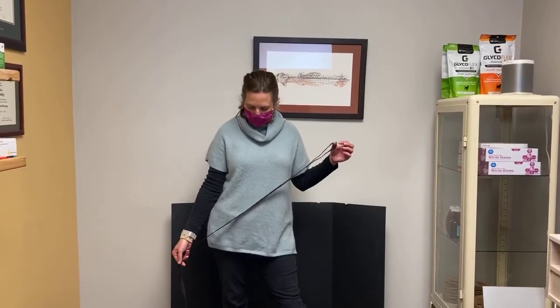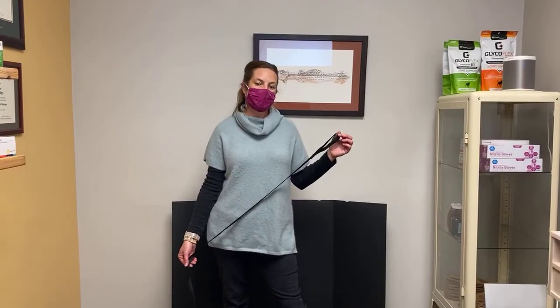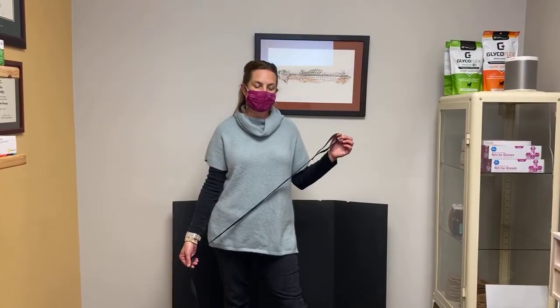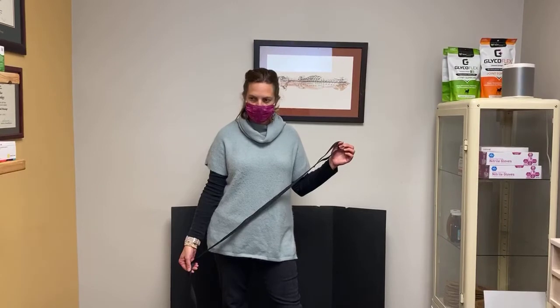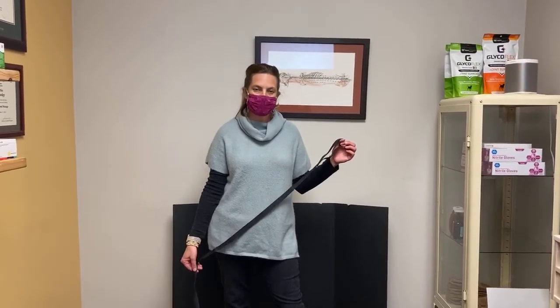First we'll do an example of what it looks like when your pet comes in to have their digi-therm run, and then I will show you some examples of some images afterwards and the kind of information we can get from it.